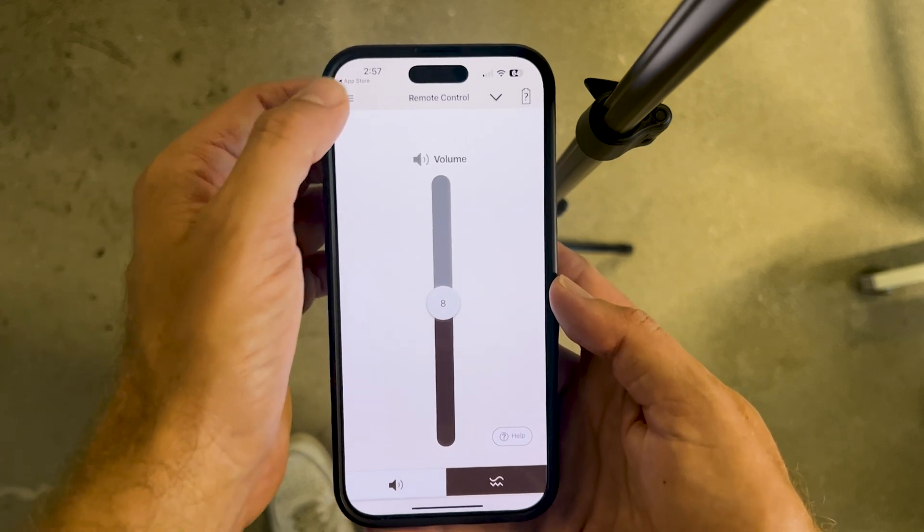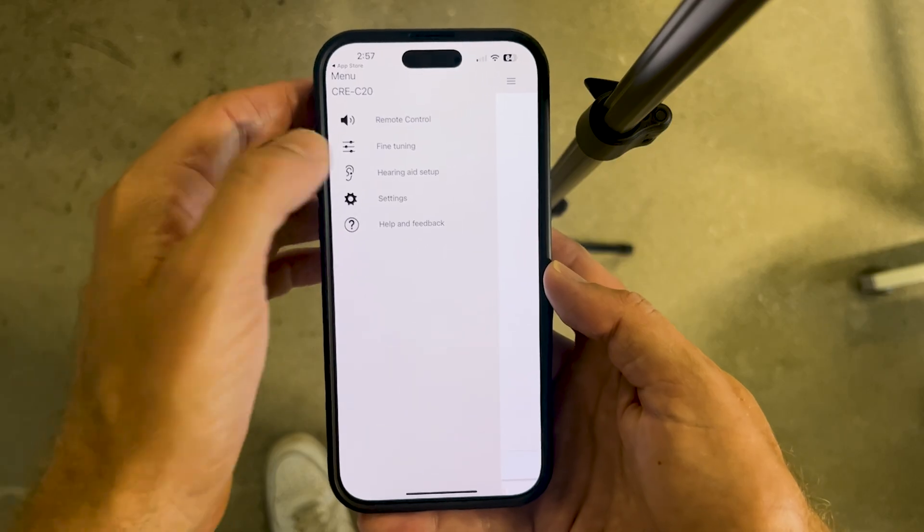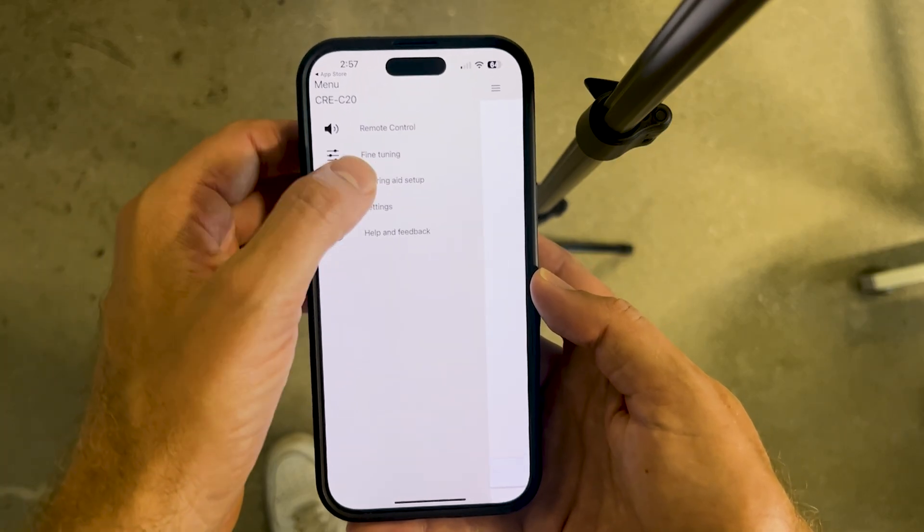That's the Sony Hearing Control app. Remember that most of the superpowers of this app are hidden in the menu section, so you'll want to head into fine-tuning or hearing aid setup. Whether you're researching Sony hearing aids before a purchase or you're a new customer setting up your devices, hopefully you now have a better understanding of how the app works along with a few tips and tricks. For more questions, head over to soundly.com, or if you're a current customer, reach us at customercareatsoundly.com or through our main phone number.